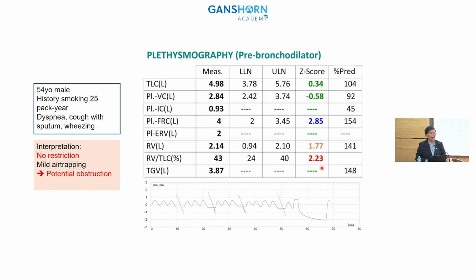So I think that there is a very specific way to determine the result of a spirometric test, and we have to do the box to confirm. Once the spirometric test is abnormal, we have to go right away to the body box.